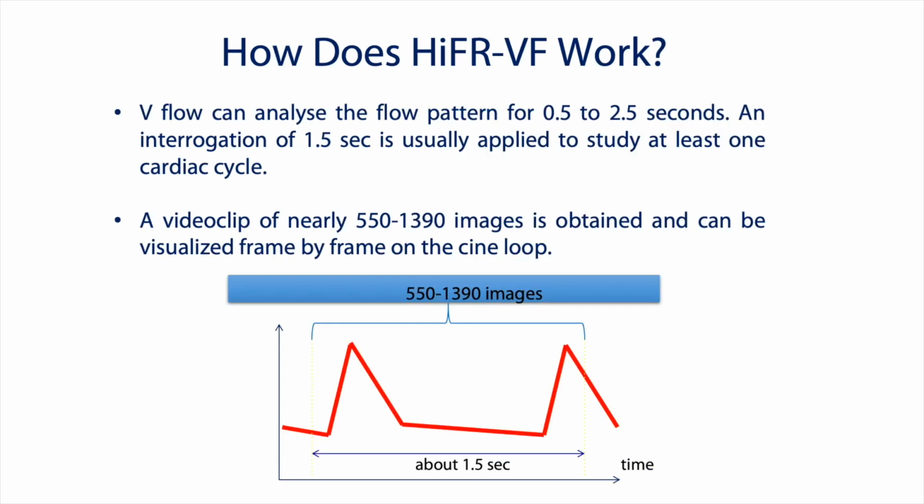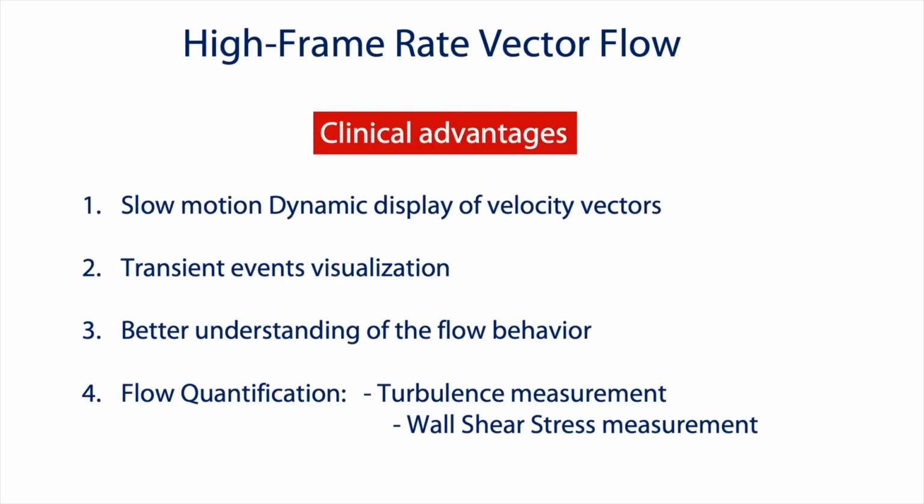How does it work? VFlow is usually applied to interrogate the flow for 1.5 seconds in order to study at least one cardiac cycle, and generates a video clip of several images which can be visualized frame by frame for further analysis. Let's move from the basic principles to the clinical applications.